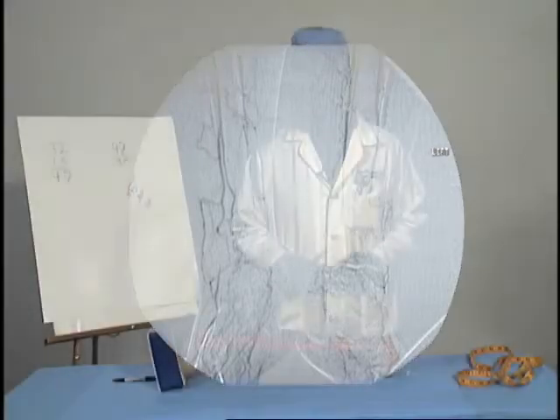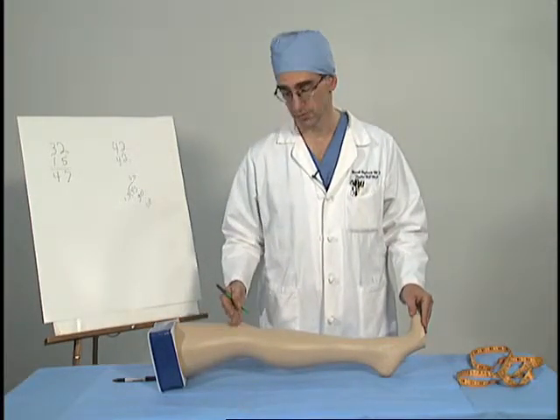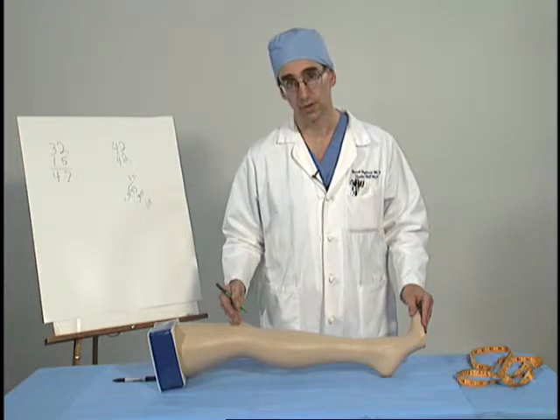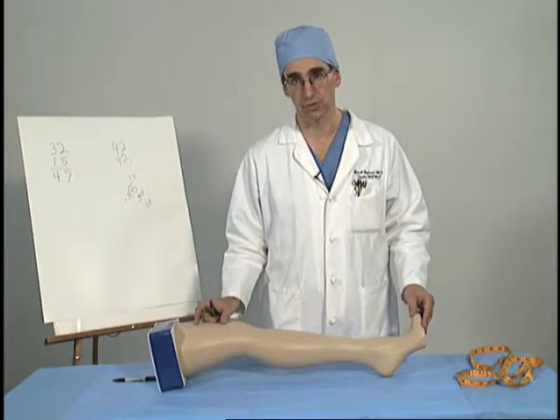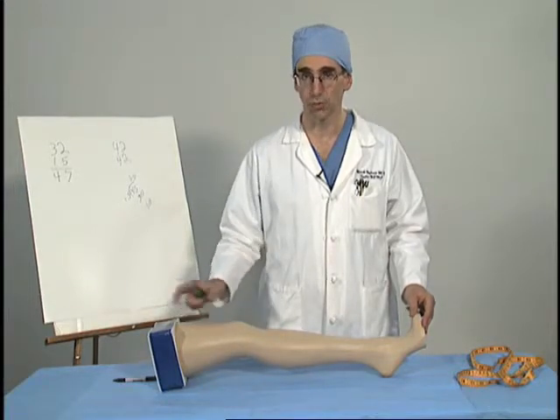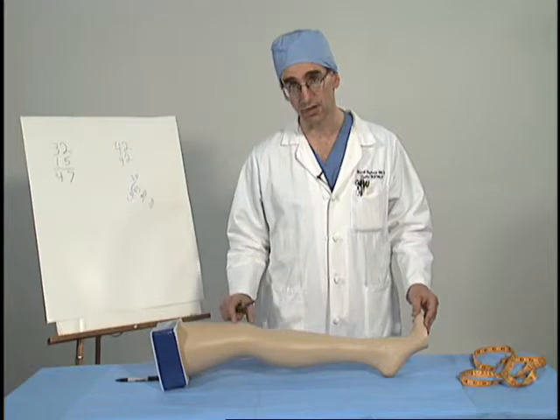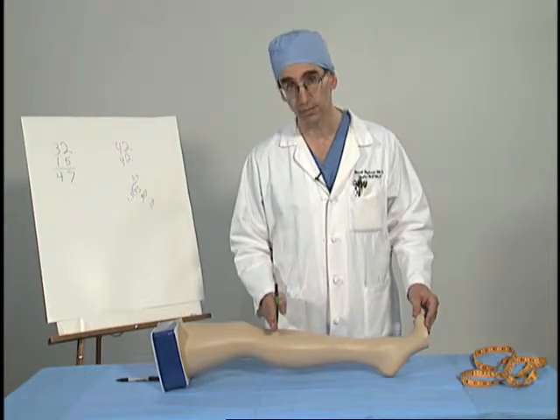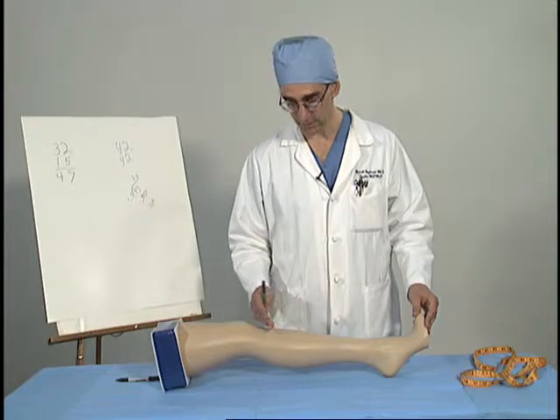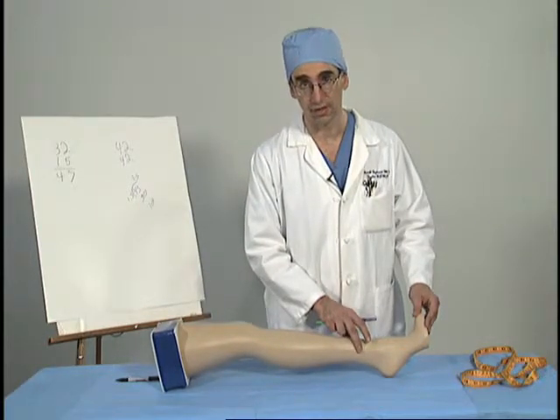So in this case, we have adequate inflow to the knee and below, despite the fact that the superficial femoral artery occludes. We see robust collateral flow into the geniculates, reconstituting the popliteal artery. That then follows below knee and reconstitutes our tibial vessels across the calf.